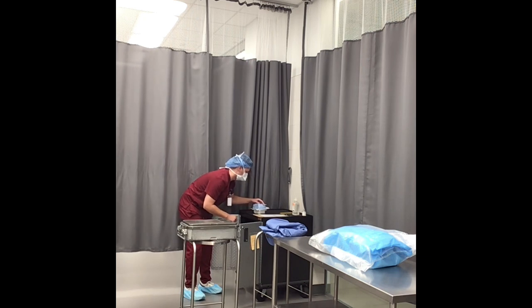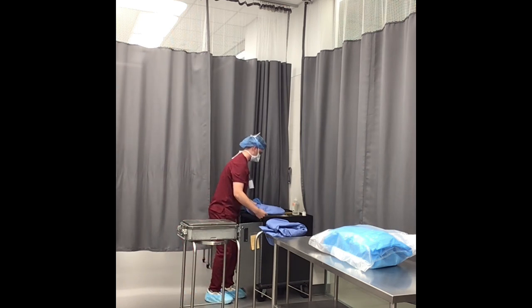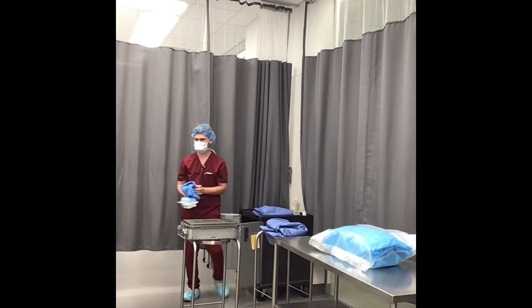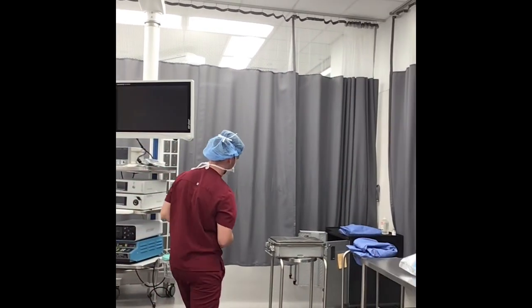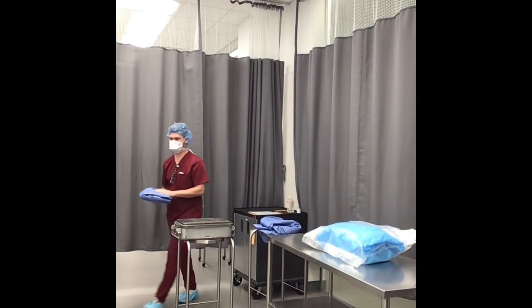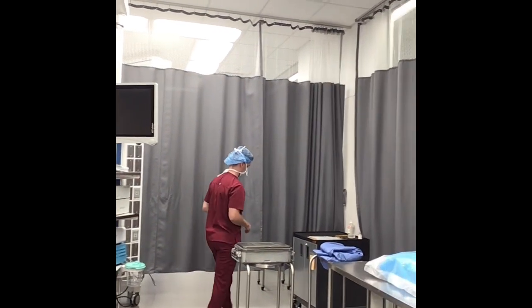Okay, so the next thing I have is my suture, my light handles, and then lastly, my Balfour. I'm just making a trip over to my OR bed, setting all this down. And then I'm going to do the same thing with my Balfour. I'm just going to place it on the flat surface for my circulator to open up to me later on.